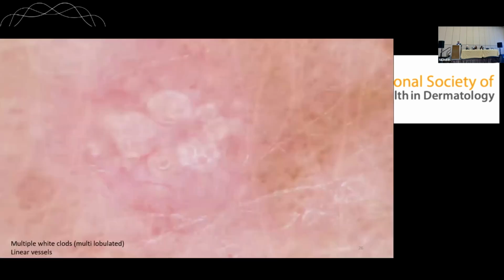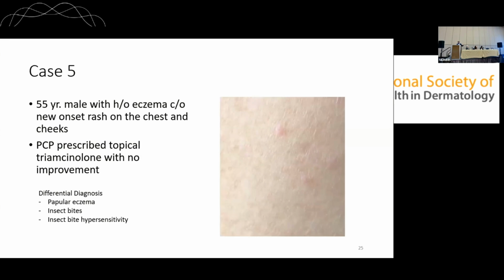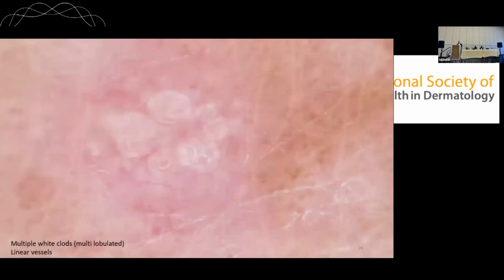And this is another beautiful case where, with similar papules, you can't make a diagnosis based on what you see. And here it is. It's a molluscum contagiosum.